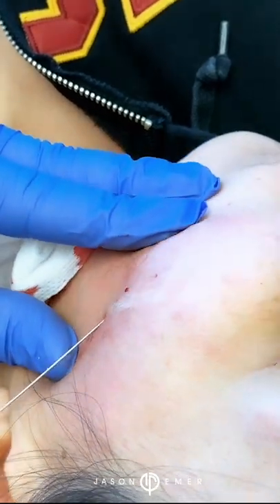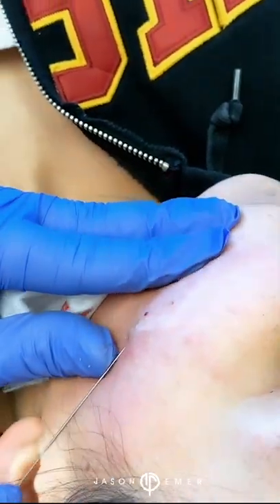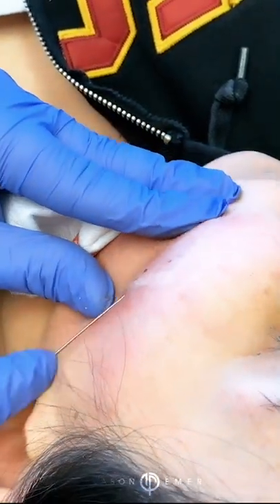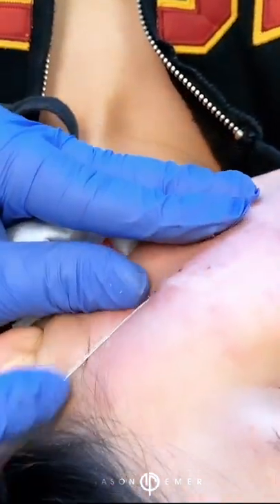Someone said we're working our magic — and that's it. So this is subcision, cannula subcision. Myself and Devin Lim do this frequently to help break apart scars. I really feel like one or two treatments with this, combined with some lasers on top with her fillers, and she'll get a really nice result. Thank you all for following.